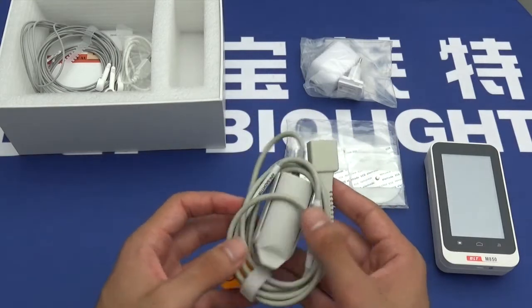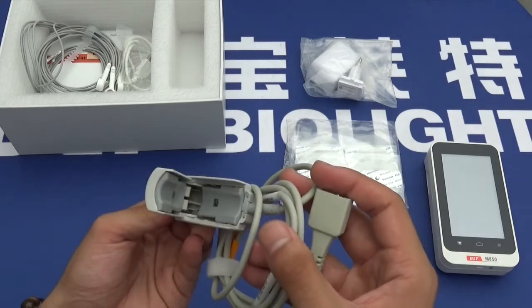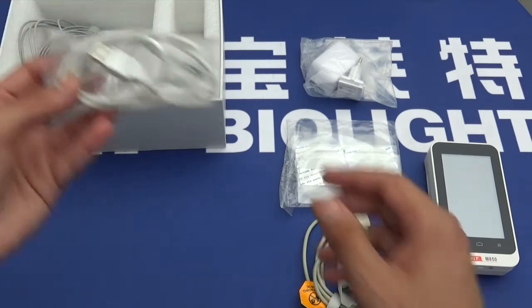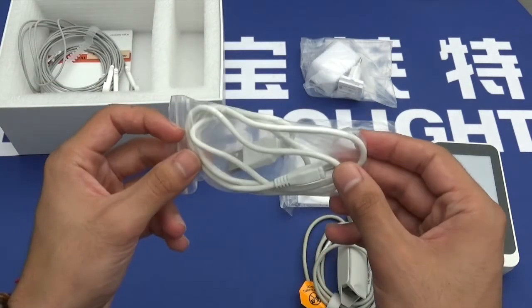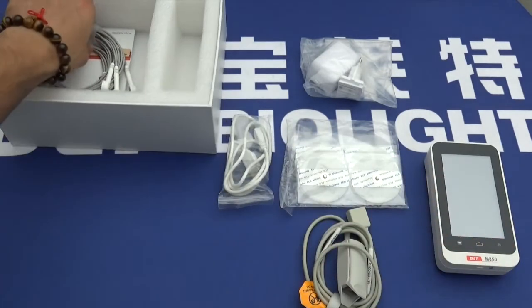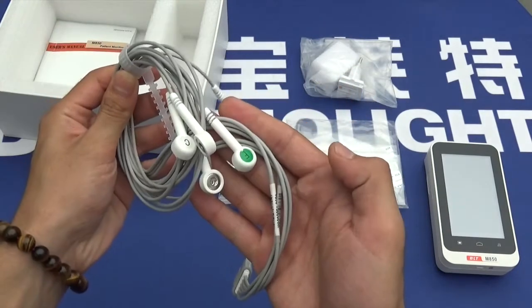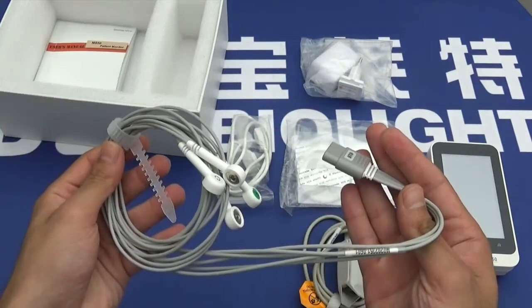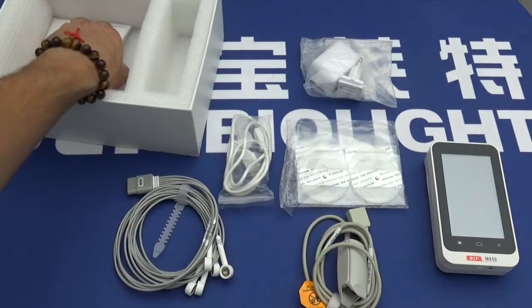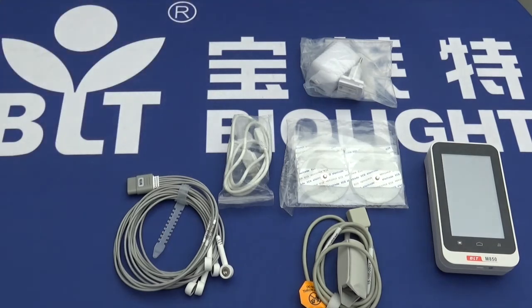Also included are a charging cable, USB to micro USB, the ECG cables — 5-lead — and finally, the user's manual.